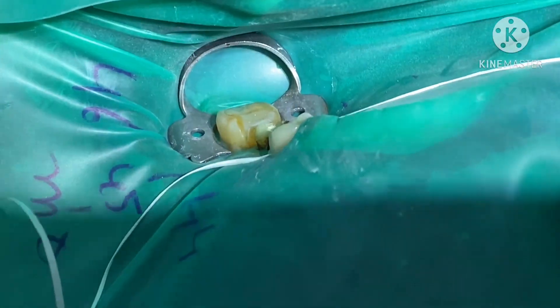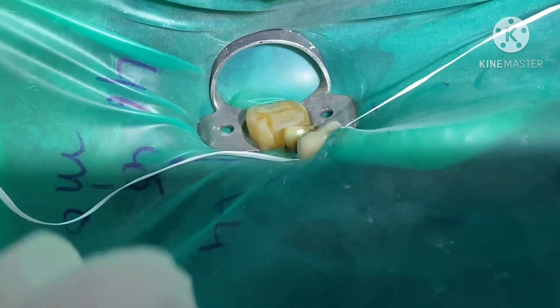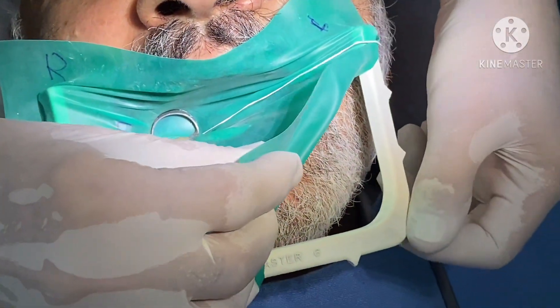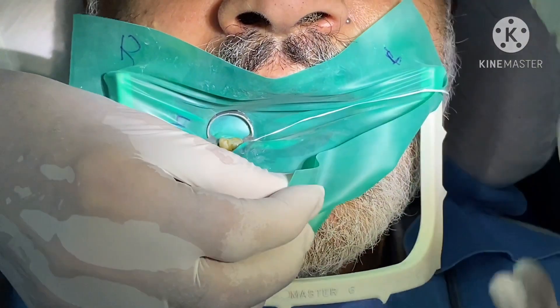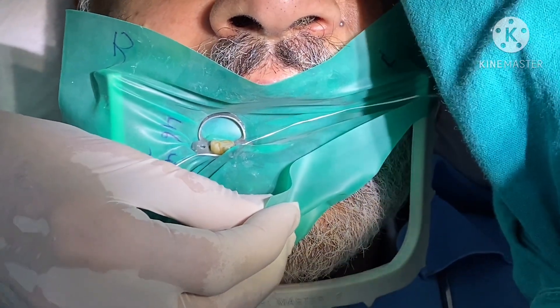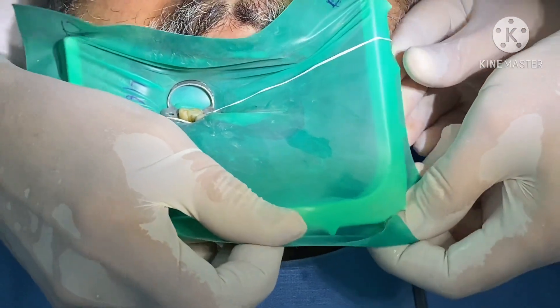This is how we slip it below the contact point — just do a zigzag and stretch it below the contact point, slowly take it down. Now you see that this is slipping all the time because the powdery side is below, and with repeated use of the rubber dam, the hook has worn off. So what we do is wet our finger and remove the powder. Now stretch it and it will hook.